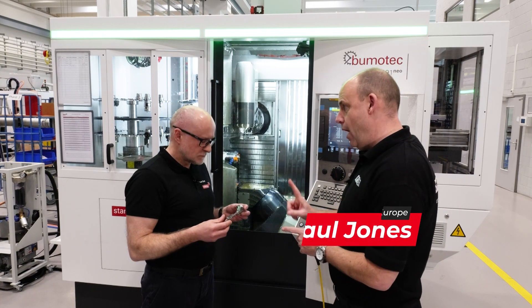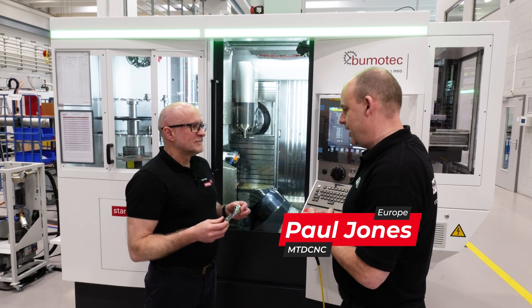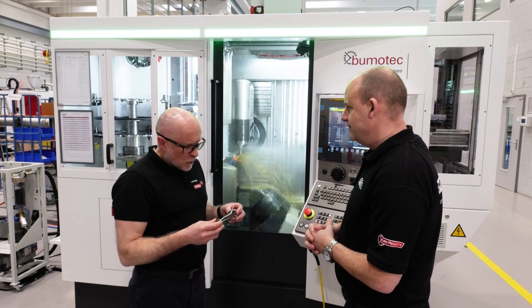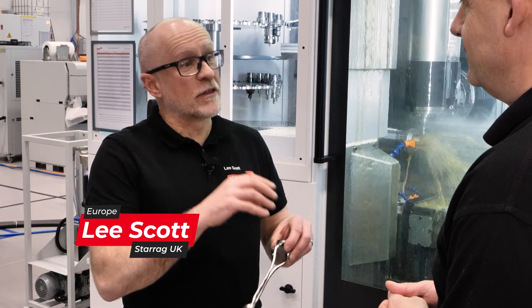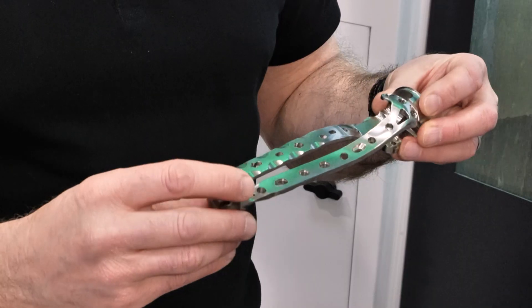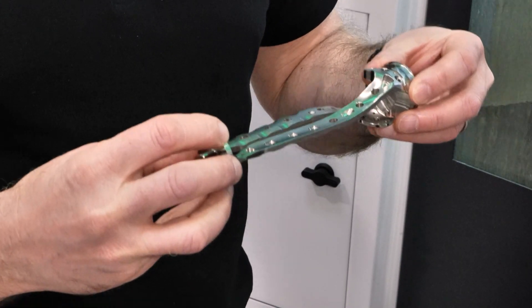We've got a bone plate here — not one but two machined on this Bumotec machine. Bone plates come in different shapes and sizes depending on where they're going to go in the body, so you could start with something very small up to something this kind of size, which presents itself with more challenges to machine.